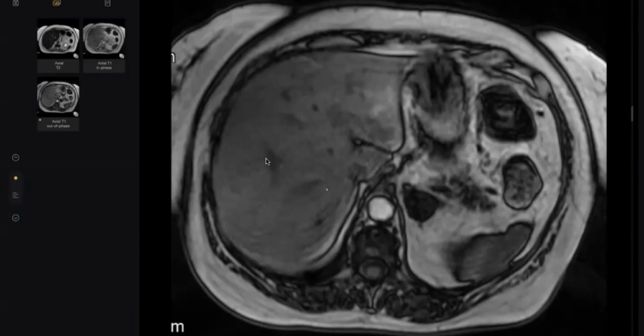Okay, doctor. If we have only CT and you have an adrenal mass, what would you do? Okay, with contrast, I would like to do the washout study ratio. That is the HU on the plain, the HU on the arterial, and the delayed. Applying the equation and getting the washout ratio. If more than 60%, it's benign. After how long will you take the delayed? I think 15 minutes. Excellent.